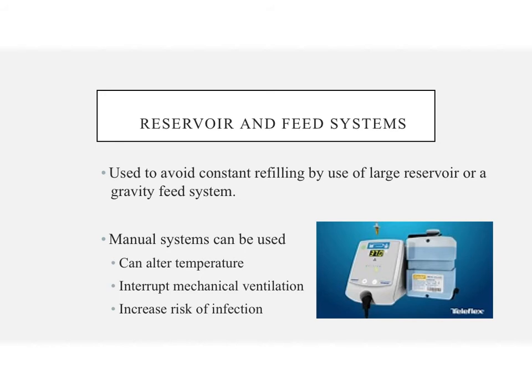The problem with that is it can alter temperature. By waiting until that large reservoir is lower in volume and adding water to it, it's going to cool down and not heat up as fast. It interrupts mechanical ventilation because the circuit is above the humidifier, so you have to take off the circuit to the ventilator, fill the reservoir, and then put the circuit back on.